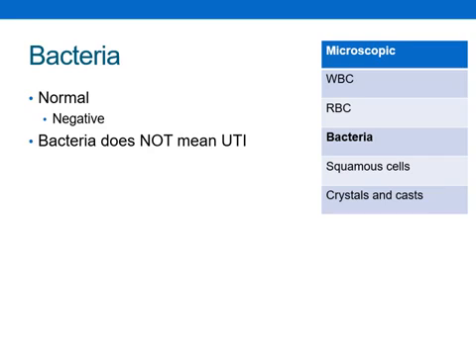To put this in a little bit of perspective from the HPF fields that we talked about earlier, about 5 bacteria in one of those visual fields would represent about 100,000 colony-forming units, which is the classical amount of bacteria present that you need to diagnose a UTI.